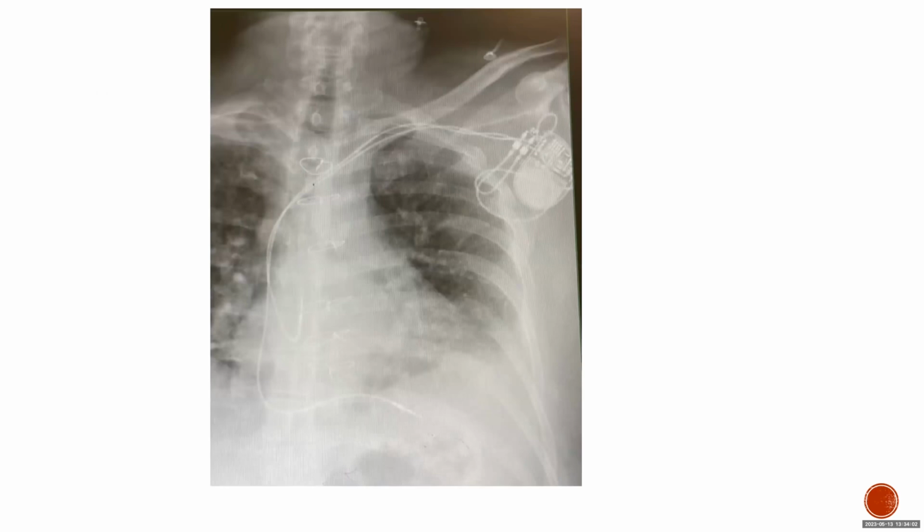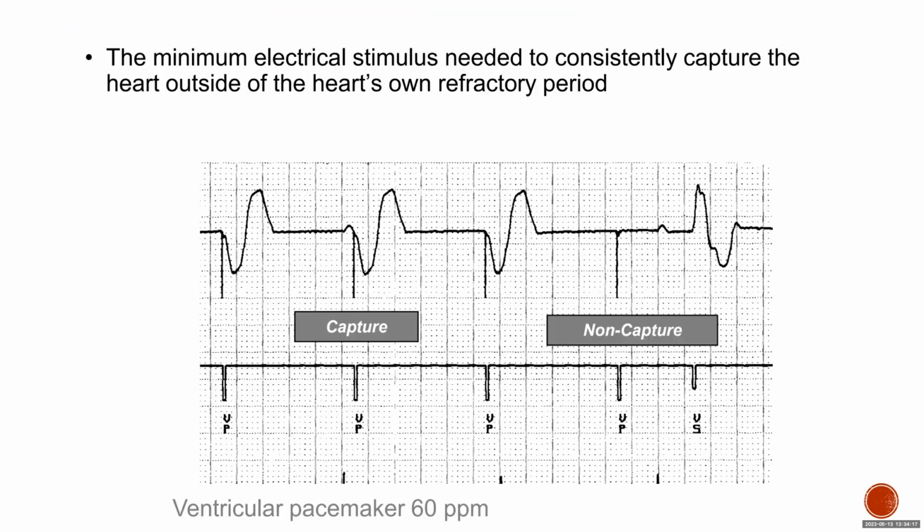Good. Any questions so far? No, good. So let's look at some X-rays. What type of device is this? Oh, can you repeat threshold? Let's just go back to the threshold. The threshold means the minimum output from the device that will capture the myocardium.